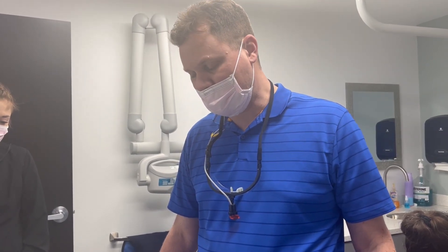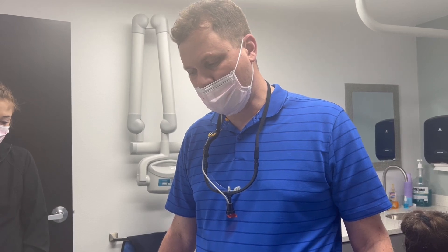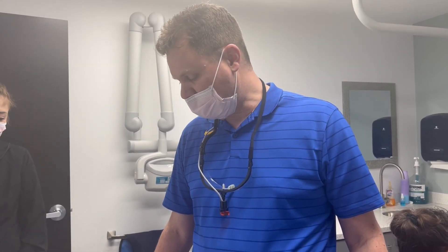Some systems have a little white ring that goes around the implant — you can use that. In this instance, the mini implants don't have a little white ring, so we're going to use light body instead.